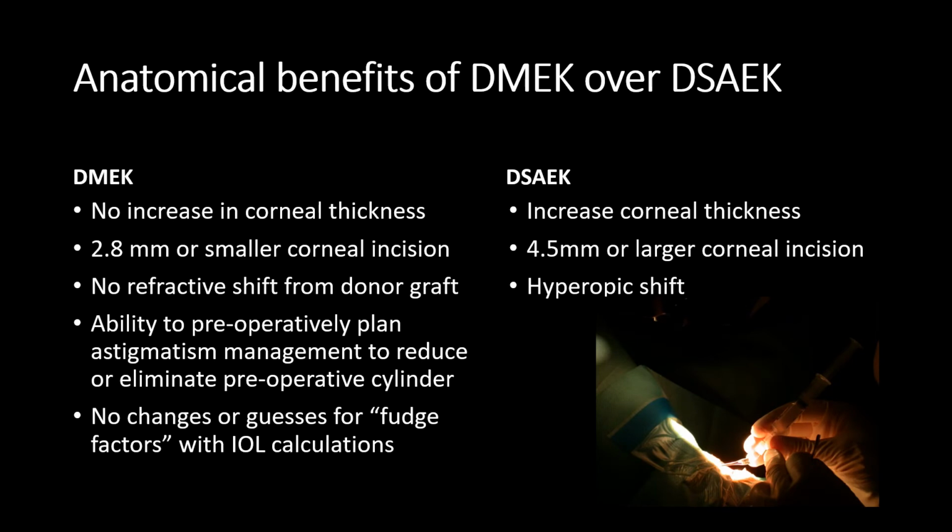Now, if we were comparing an endothelial keratoplasty procedure with a penetrating keratoplasty procedure, it will be fairly clear that an endothelial keratoplasty procedure has many advantages over a PK procedure. But if you're comparing a DMEK versus a DSEK procedure, then you'll find that the DMEK has many advantages in that it alters the anatomy less and it has a higher refractive predictability.